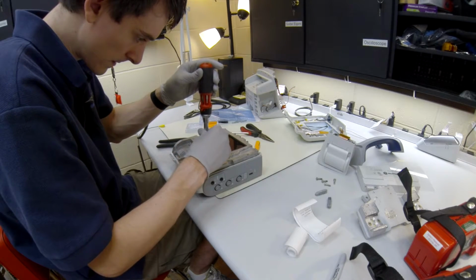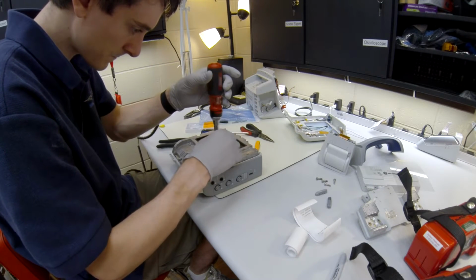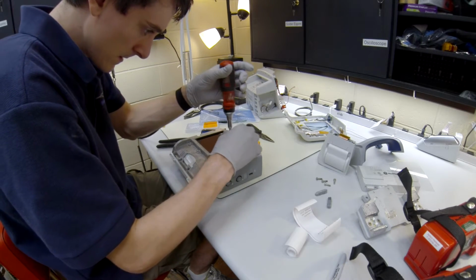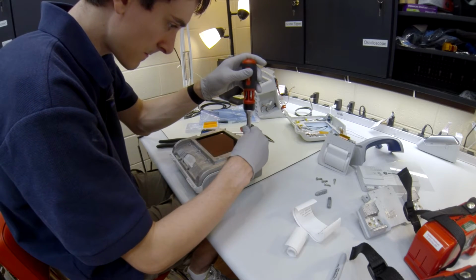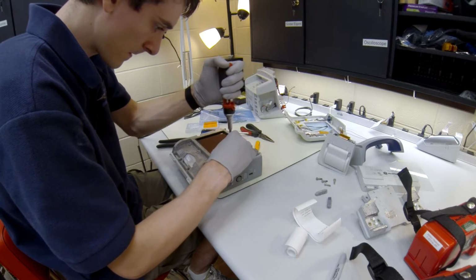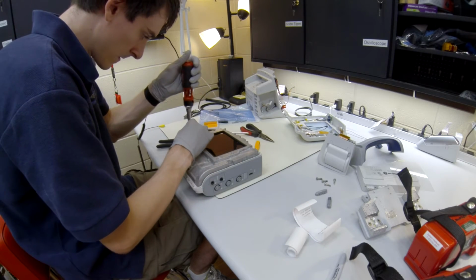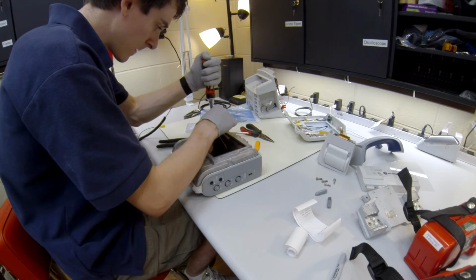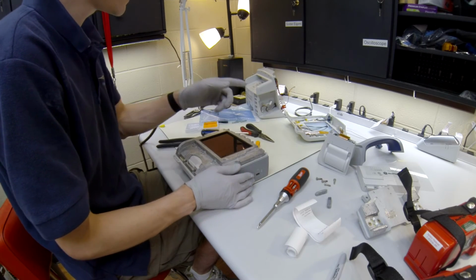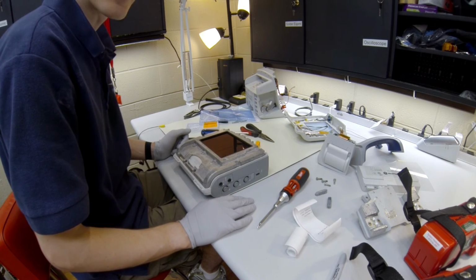I'm not tightening it all the way. Torque values will be in the service manual. I couldn't tell you what it is right now. Tightening those up. Okay, so we have that piece together. All we need to do now is add the new faceplate, add the backing, the printer, put it all together, and test it, and we're ready to go.